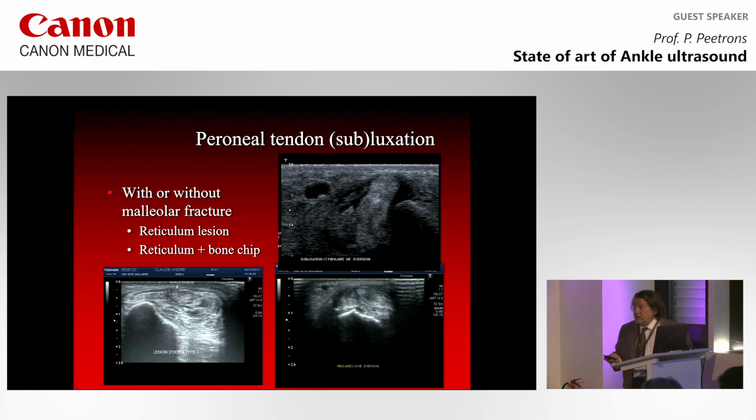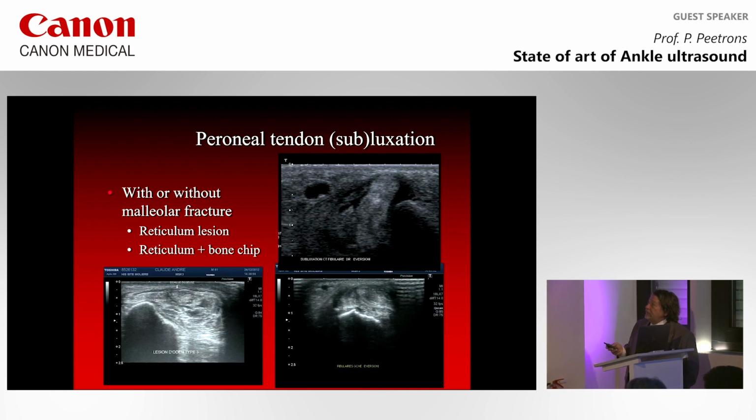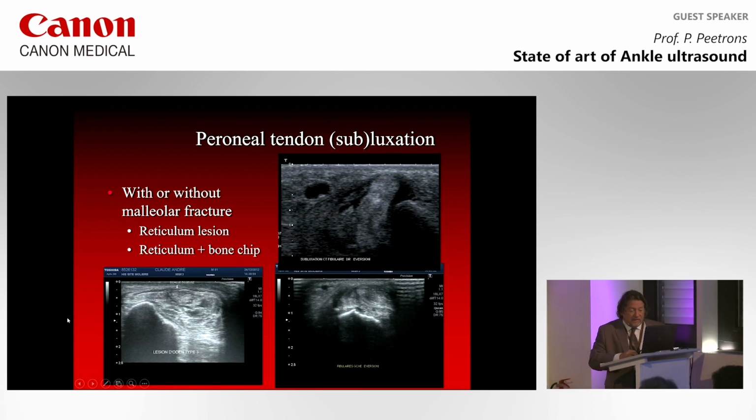Subluxation, I told you, you have to do the eversion maneuver, and you try to find whether some tendon, one or two, or both, can go between the skin and the fibula. Normally, it's not like this.